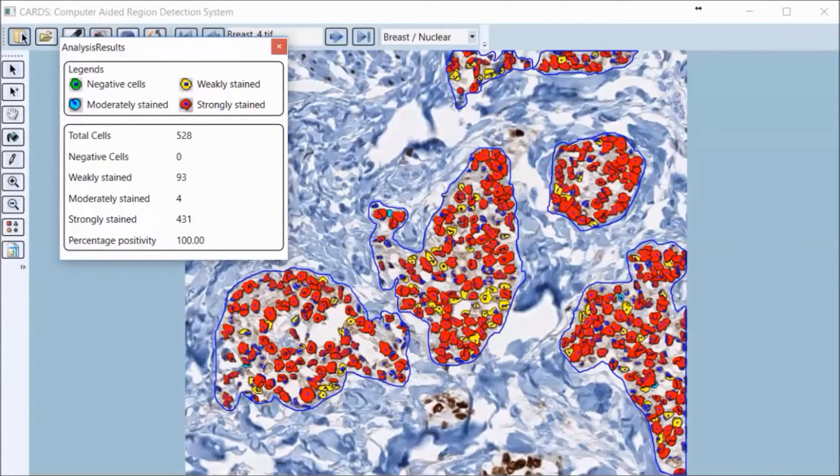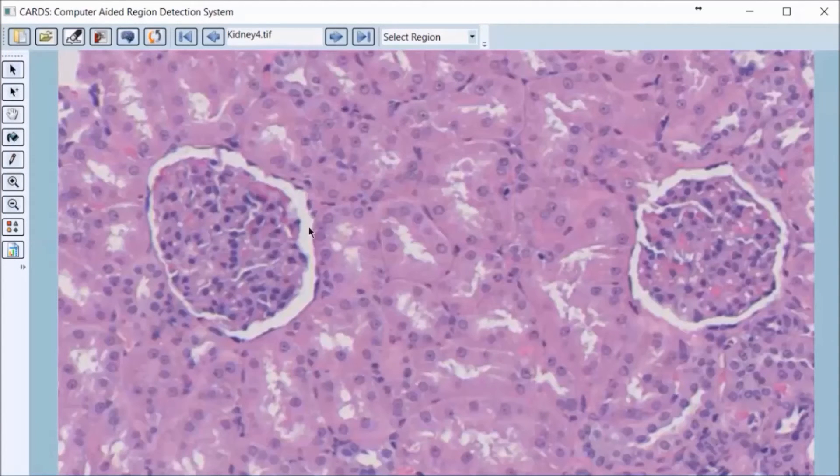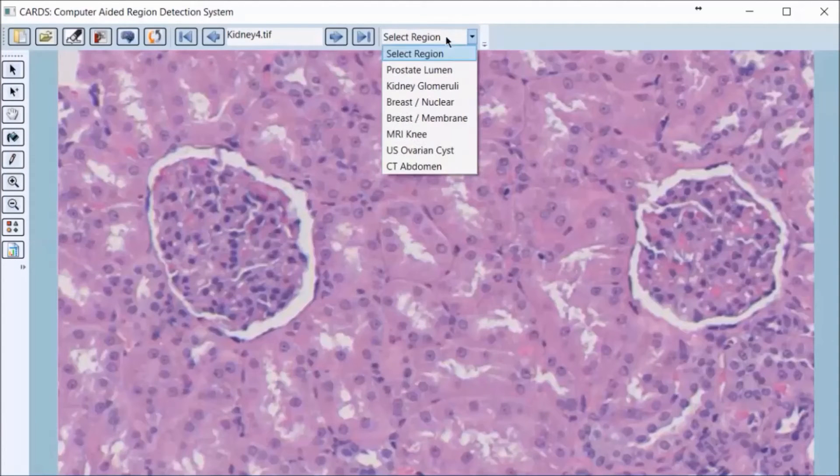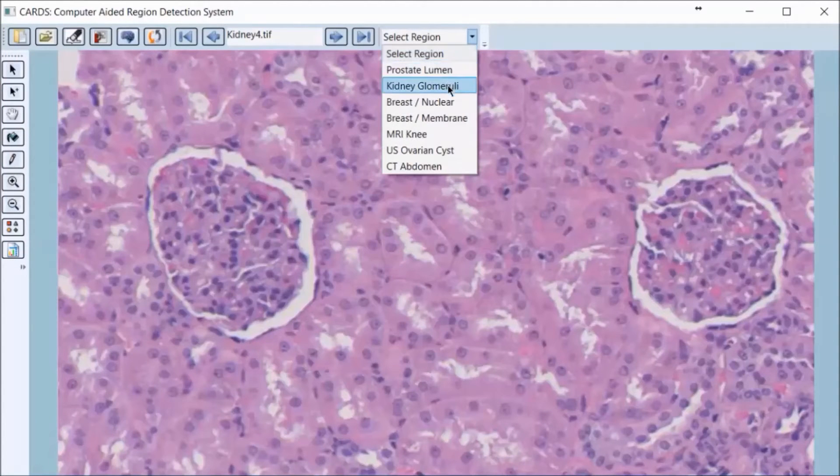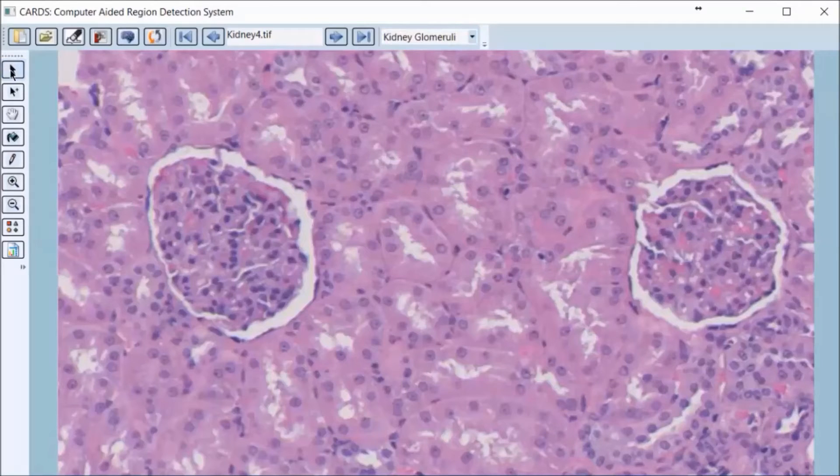Next, we have a kidney morphology image and selecting the kidney glomeruli algorithm will automatically highlight only the glomeruli regions upon user selection.